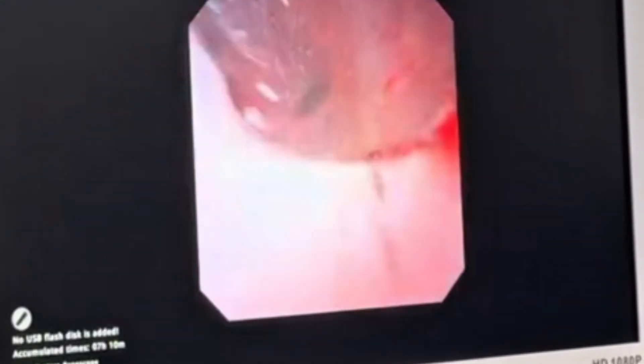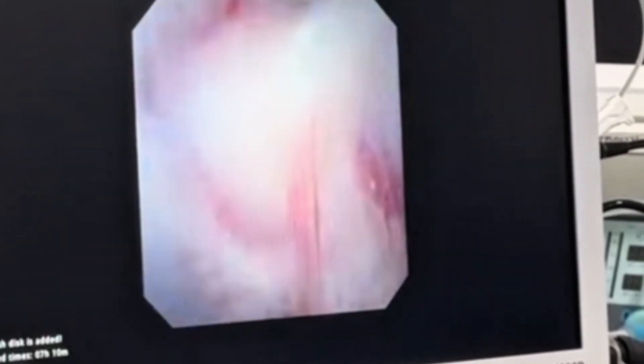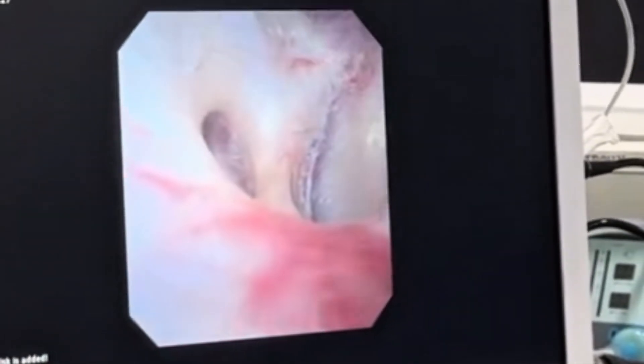During inspection, we locate the kidney stone in the middle calyx. Smaller fragments are also seen in the inferior calyx, which are flushed out with irrigation pressure.